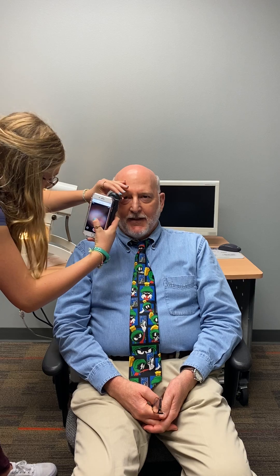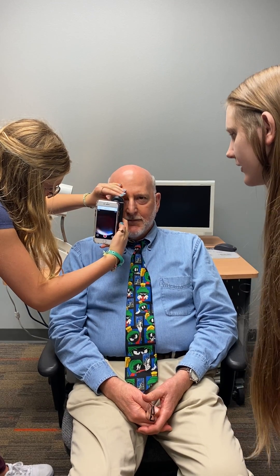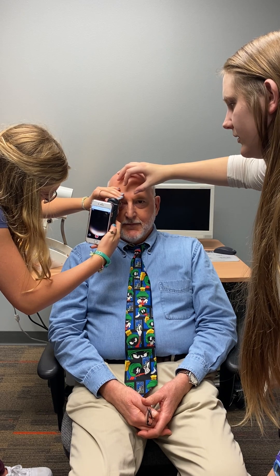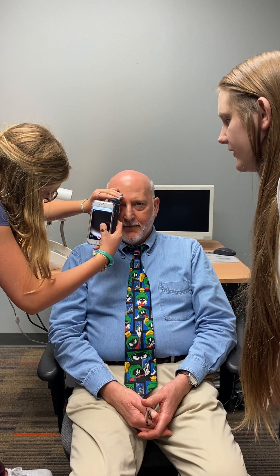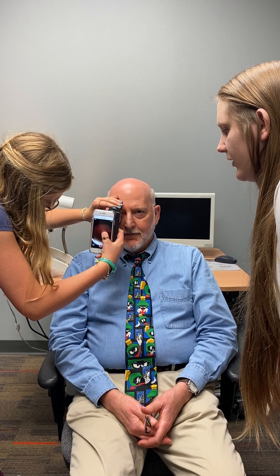Go ahead, get a picture. Kimberly can help — you're going to need to go a little toward you. Make sure you have it right in the pupil. Oh, there you go. You tap the screen, make it a little bit clearer. Those are pretty good. All right, there we go.